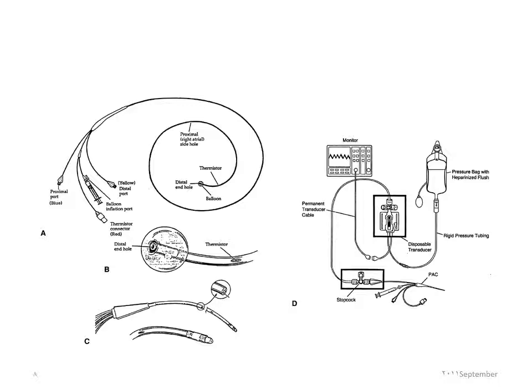Also drip chambers, solution, cuff pressure, and heparinized solution to prevent any clot. It's the same system.